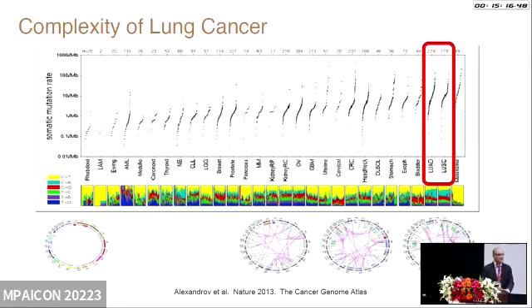I wanted to bring this case to highlight how much we have come along in terms of lung biomarker testing. About 10-12 years ago, when I started testing for lung biomarkers, we were thinking about EGFR, then came along ALK, ROS1, PD-L1, and then we moved on from the platform of RT-PCR to NGS testing, and that expanded. So this case just highlights what we are finding on these tests now, and it's very interesting.